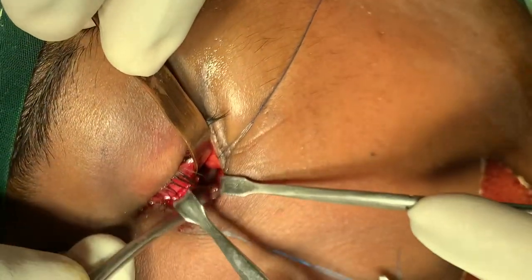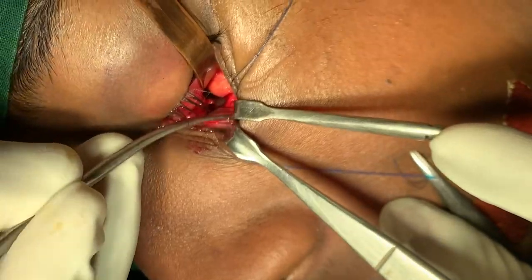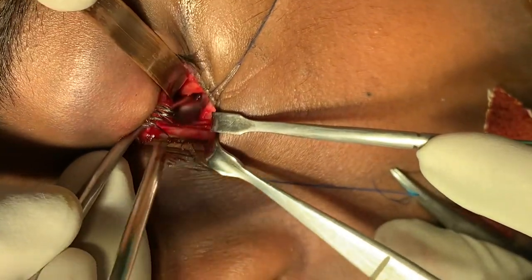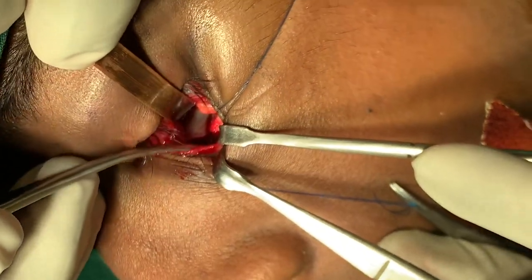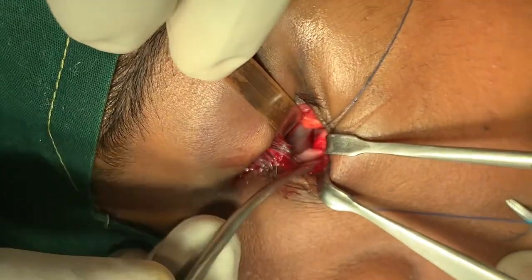medially. Yeah, you can see that the entire segment is now coming into view. So this is a good approach for tiny fractures like this, but even small fractures like this can leave a residual deformity because this patient has a blowout type of fracture. You can see there how it's shattered there.